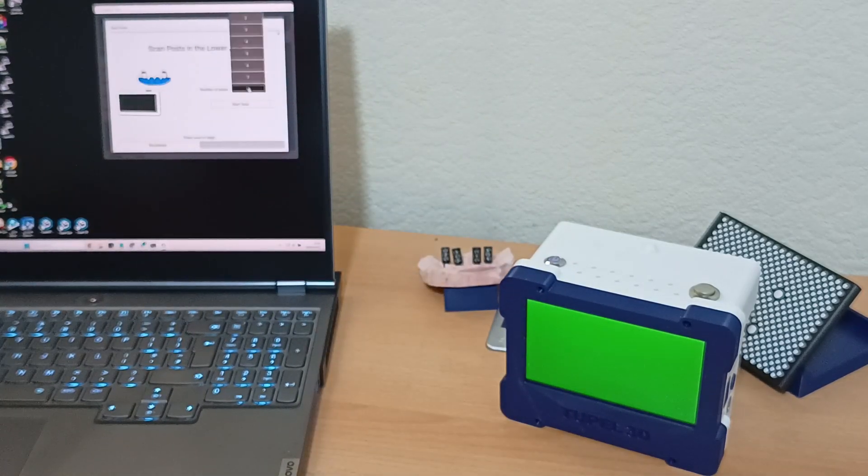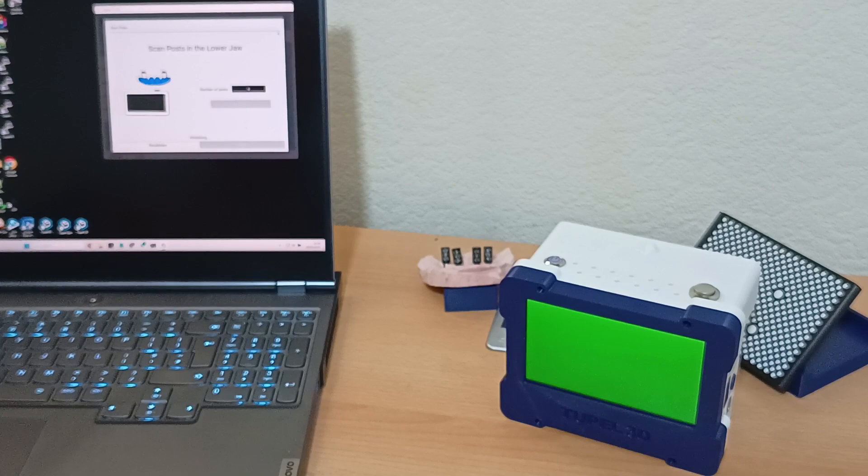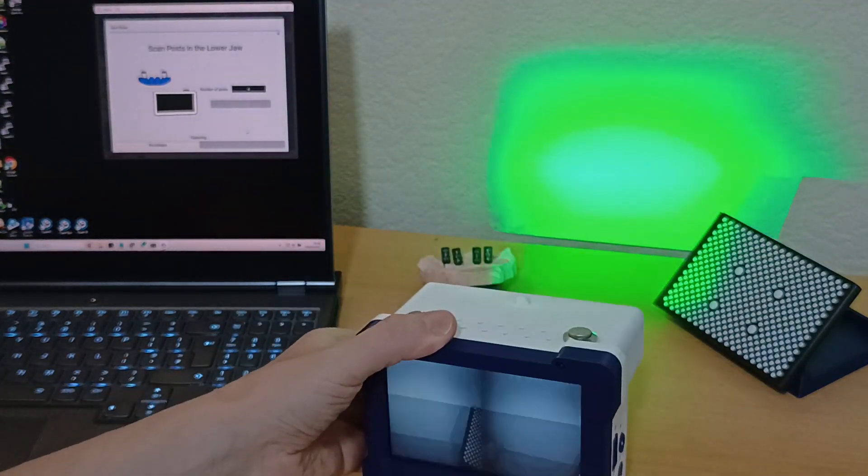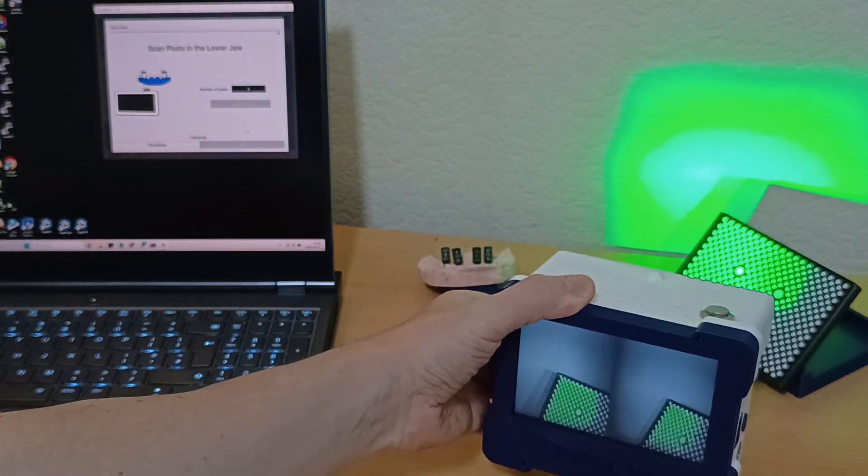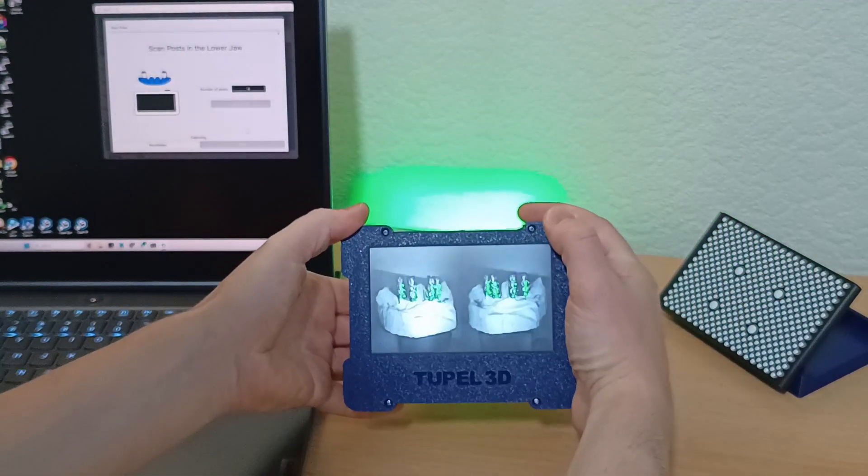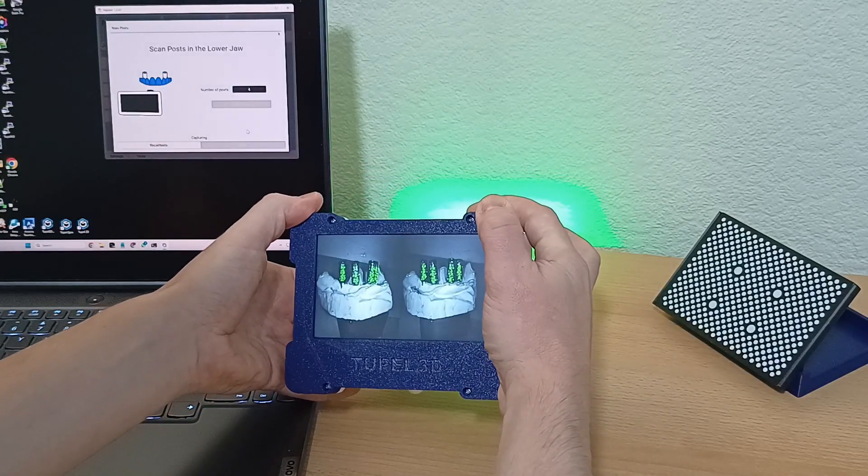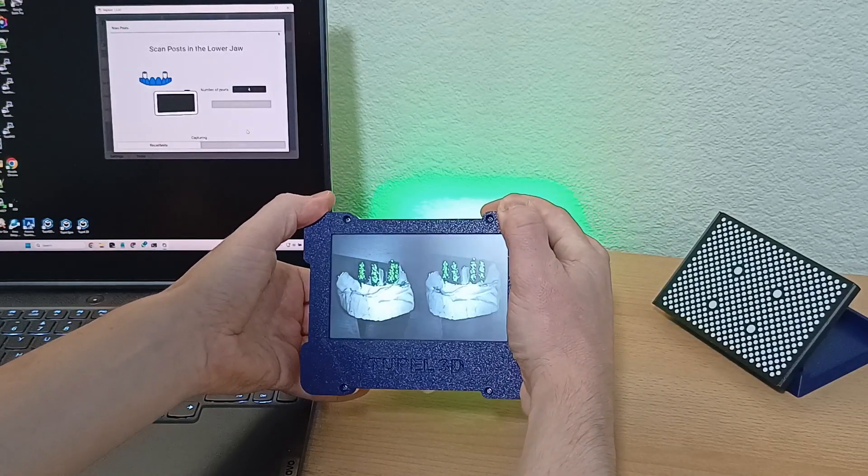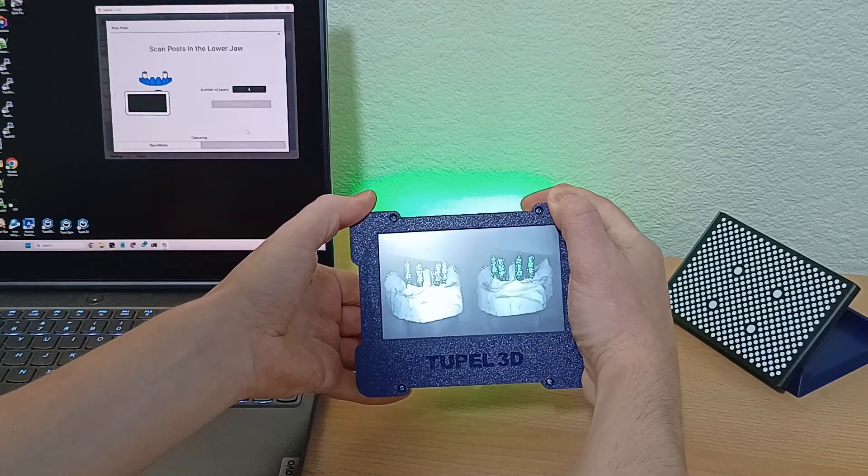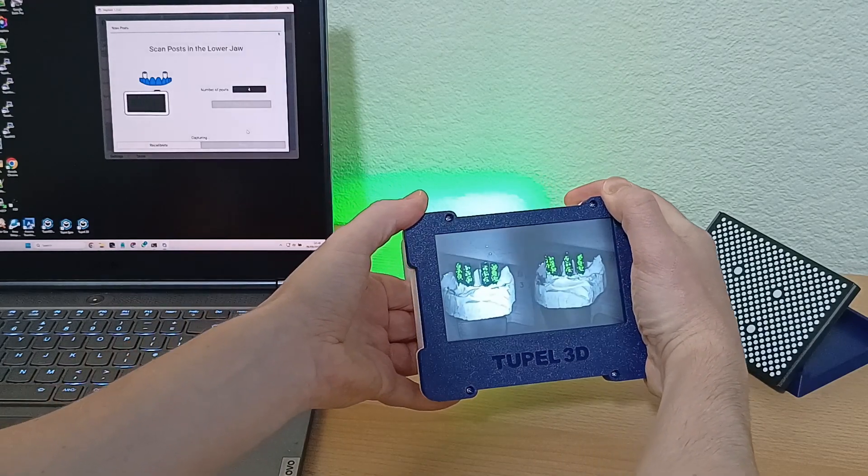I'm telling the software that we need to scan four posts. Then we've got to point the scanner at the posts, hold the trigger, and move it around so it gets a clear view. As soon as the scanner screen goes back to green, it's done.